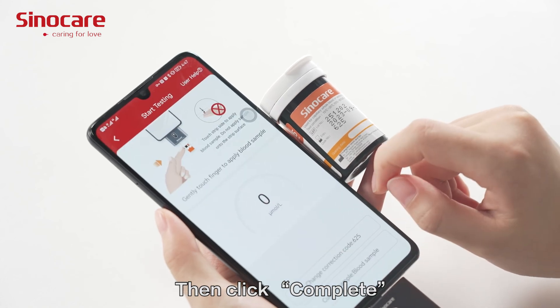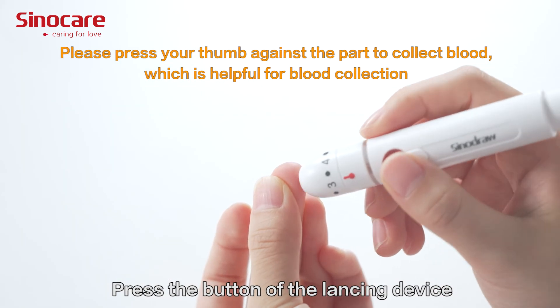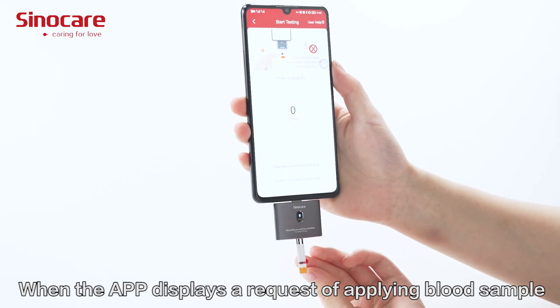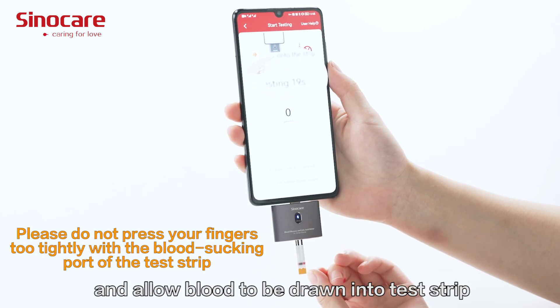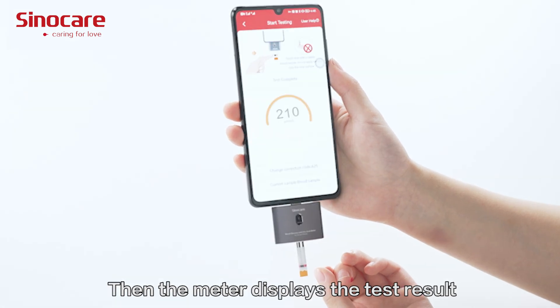Then click Complete. Disinfect the blood collection site with a 75% alcohol pad and press the button on the lancing device. When the app displays a request to apply a blood sample, touch the strip side to the blood drop and allow blood to be drawn into the test strip. Remove the test strip from the drop immediately once the meter enters the countdown from 25 to 1. The meter then displays the test results.